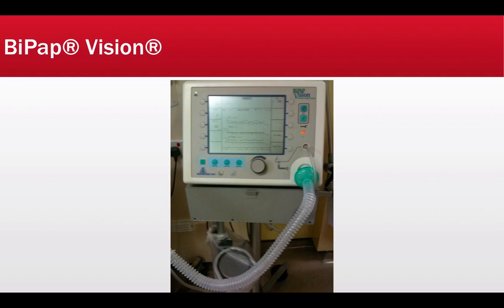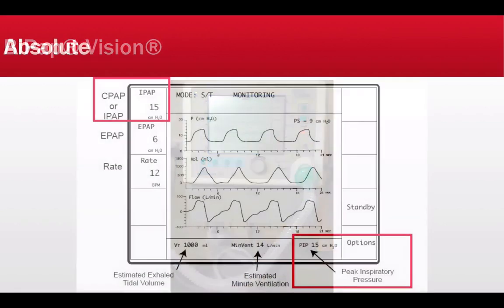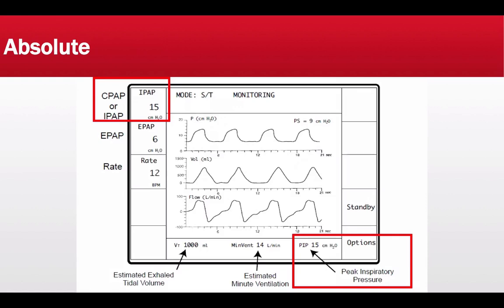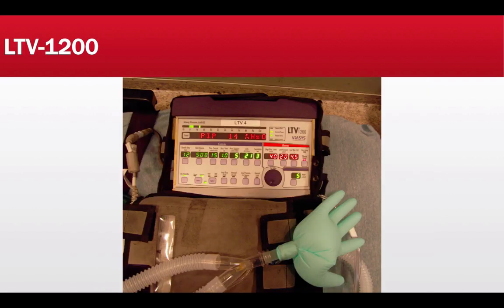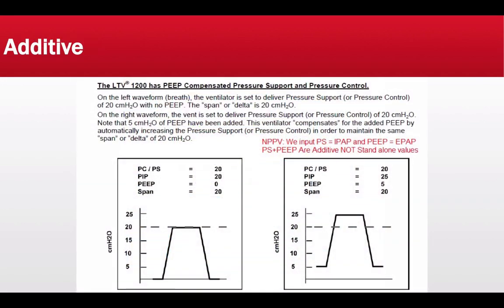Here is a BiPAP Vision machine by Respironics. Whenever you arrive at a facility, this is the interface you will see. At the top left-hand corner, IPAP is set at 15 and EPAP is set at 6. At the bottom, peak inspiratory pressure reads 15 centimeters of water pressure. Peak inspiratory pressure is the pressure in the circuit to the proximal airway at end inspiration, and it's absolute — IPAP and EPAP are not additive. The LTV-1200, on the other hand, has pressure support in addition to PEEP, as clearly demonstrated in its user manual.